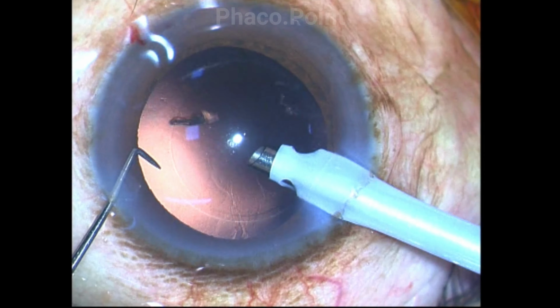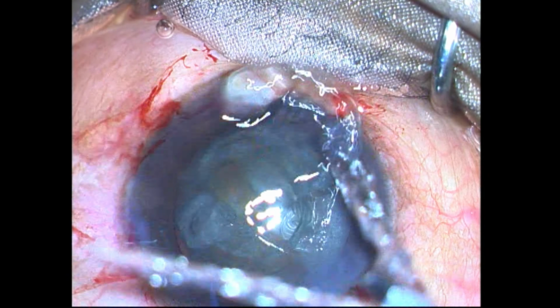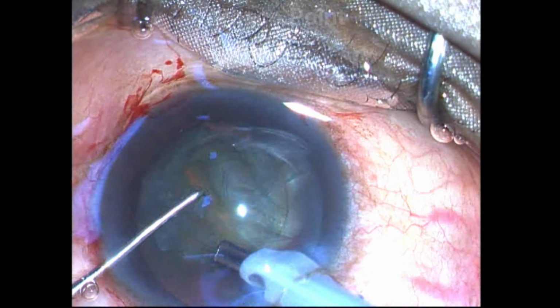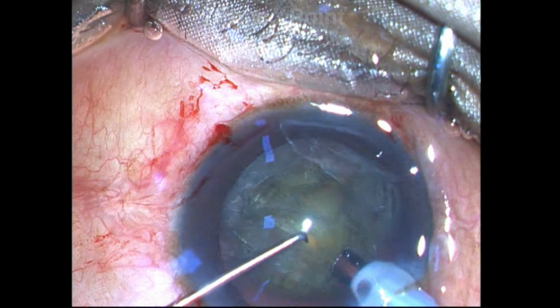Let's watch the next case now. This patient has got a slightly harder grade of cataract, like a grade 2 or 3, and the surgeon is about to perform the phaco. With the irrigation on, the surgeon then introduces the phaco probe into the eye, turns the bevel into a bevel up position, and then proceeds with the direct chop.